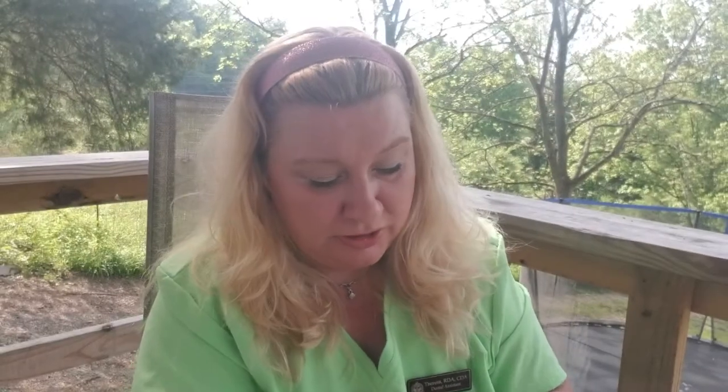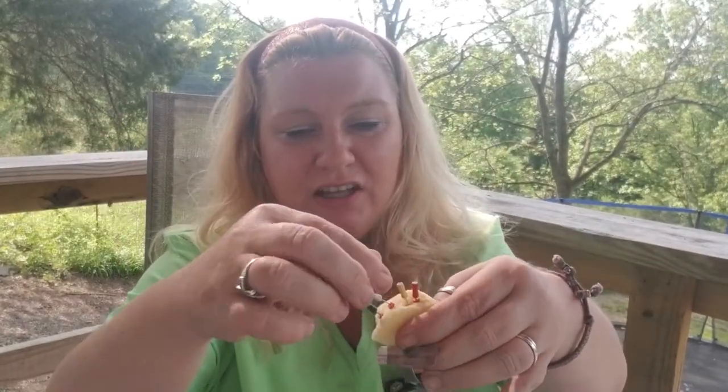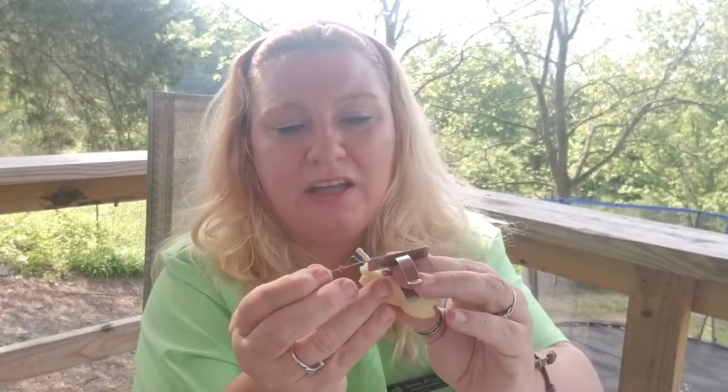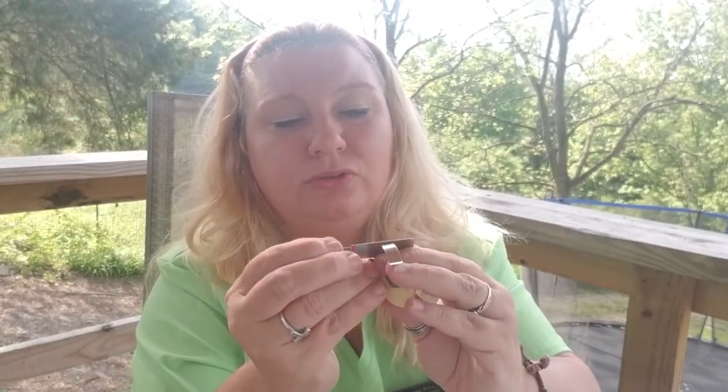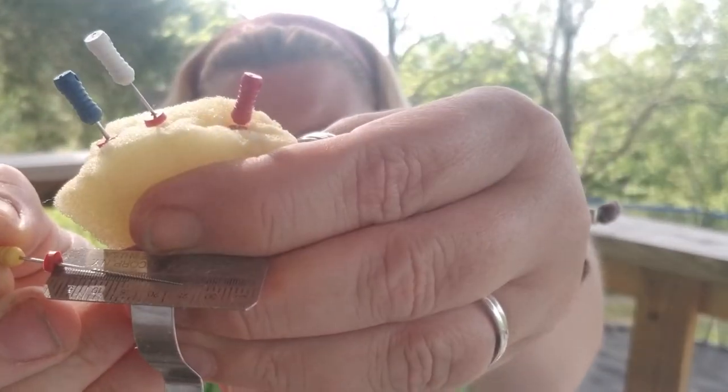When you are measuring files, make sure that you have the endo ruler. You have them in order from 8 to 70 if you need it. You pull it out, and if they say measure it to 25, you take that rubber stopper and you move it until it's there. That is how you measure endo files. The endo ruler could be on different things and these could be put in different things, but this is basically how you do it, and they all get sterilized.